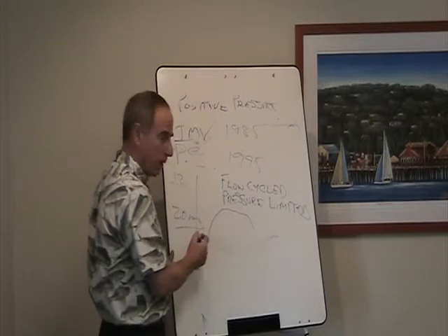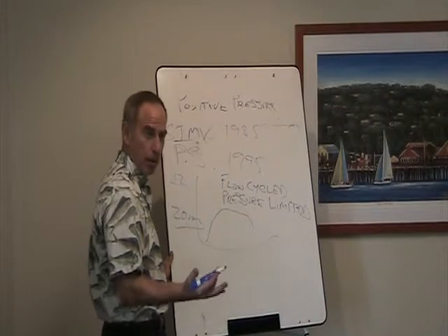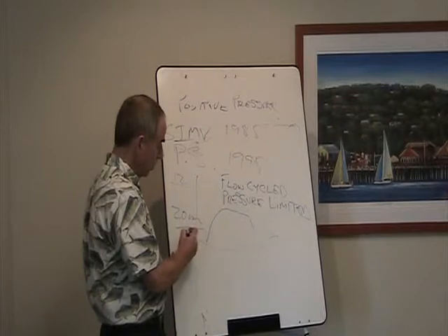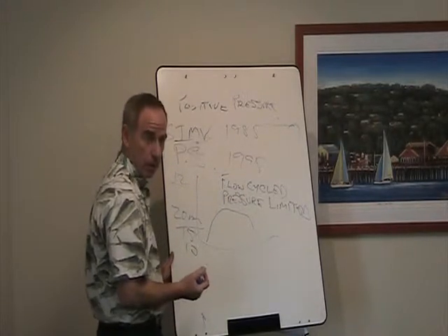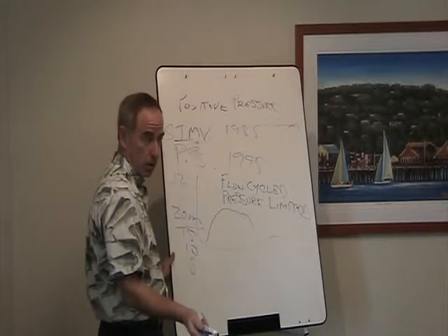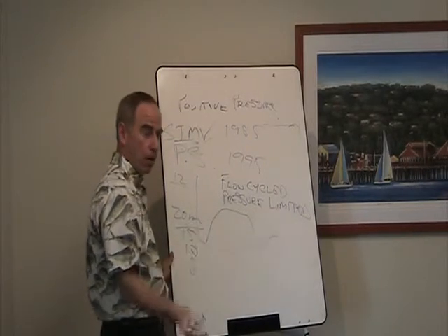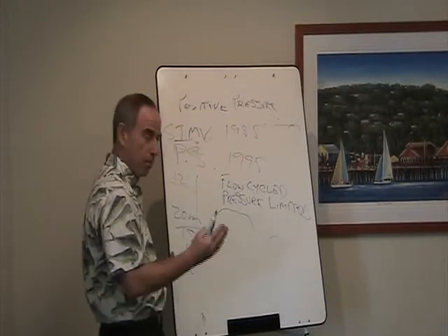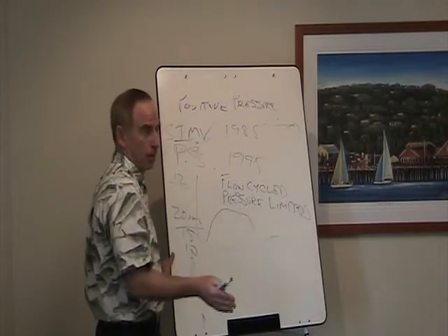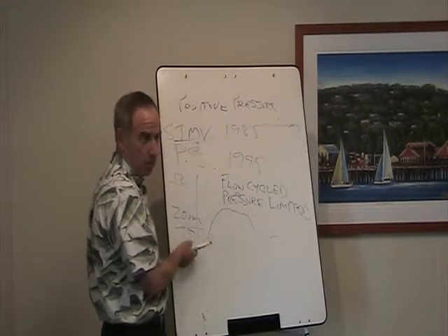Well, with pressure support, the idea was we'll start them out on a lot of pressure to almost fully support them, or even fully support their breathing, so they're doing almost no work. And then we'll gradually go down on the pressure. And as we go down on the pressure, the patient has to lift more, right? They have to work harder. Or as they are able to work harder, we can go down on the pressure. So it's every breath. Every breath gets some support as their condition improves and their work decreases, and they're able to do more and more work of breathing.